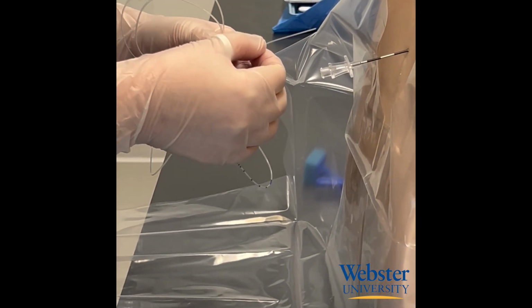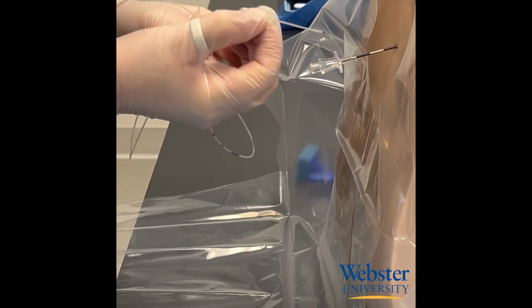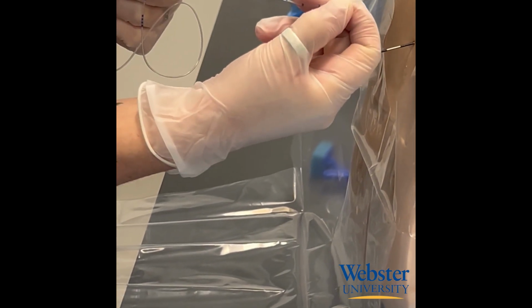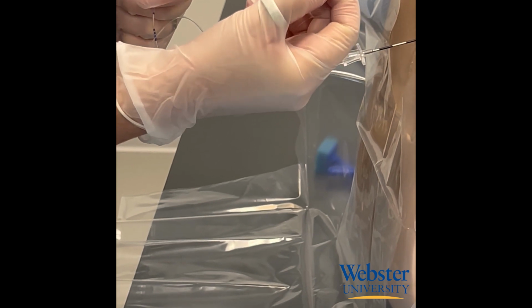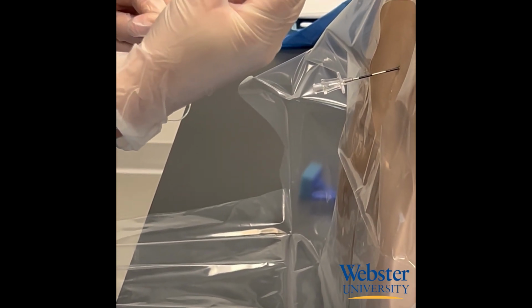No matter what, I want to insert the catheter until there's 3 hash marks seen in the window of the needle. That way I know there's 5 centimeters sticking out the end of the catheter in the epidural space and 10 centimeters inside the needle.